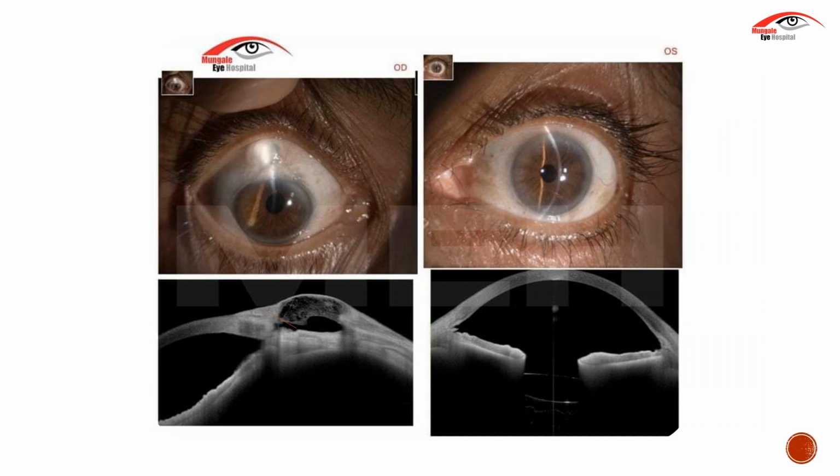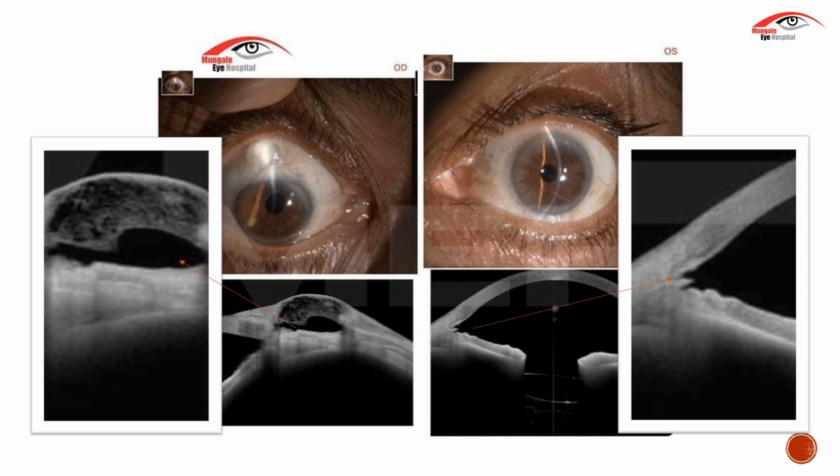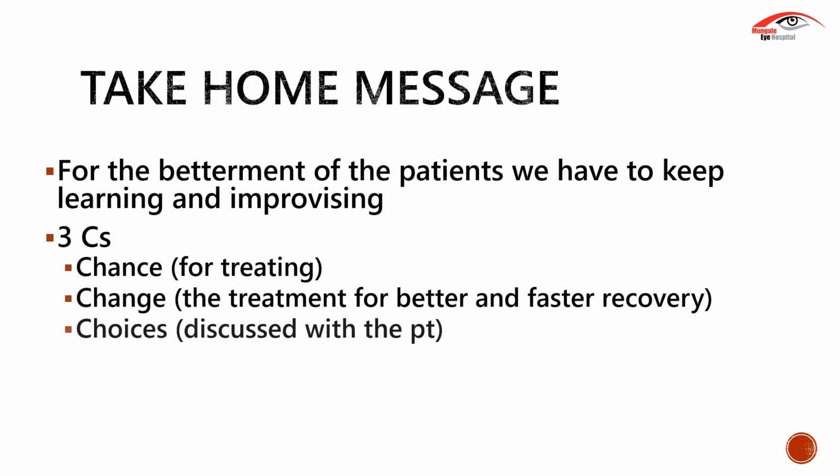Here we can see a patient whose right eye underwent a trabeculectomy and the left eye underwent a GATT surgery. In the right eye, the patient would have to live with an ostium all his life, versus the left eye, where we may not be able to tell which surgery was done. Here, only an OCT can help us by demonstrating the trabecular shelf sign. Which one would you choose for your patient?